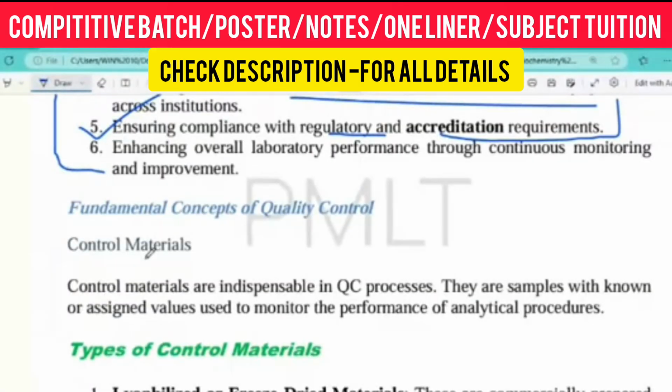Okay, now we are understanding the fundamental concept of quality control. In the previous section we discussed the introduction, right? Now we are going to the fundamental section. What is really required for running quality control?